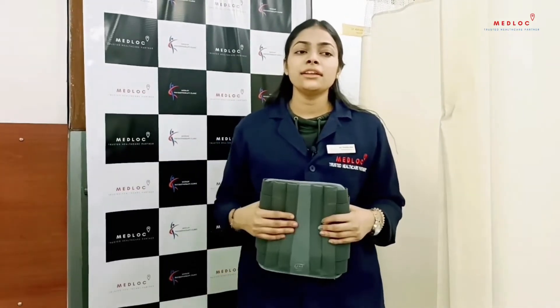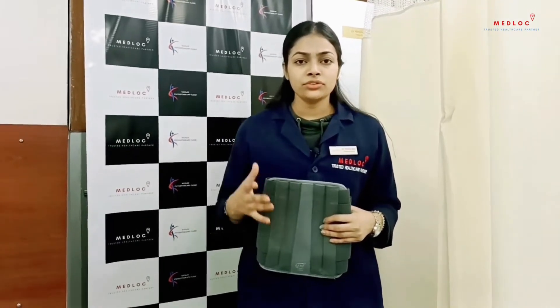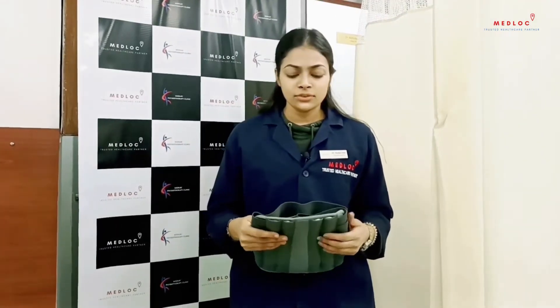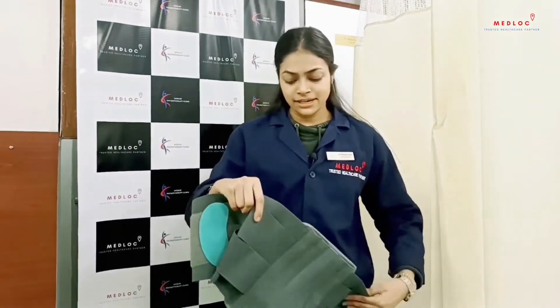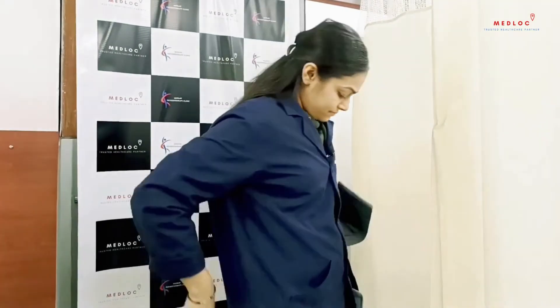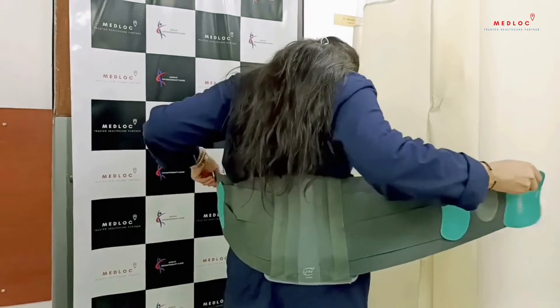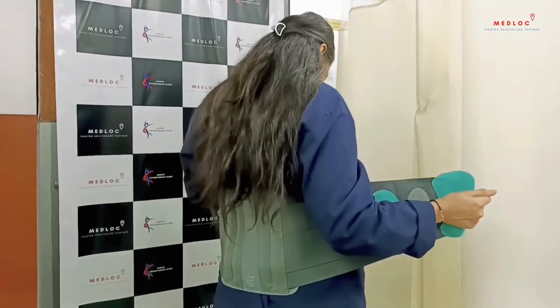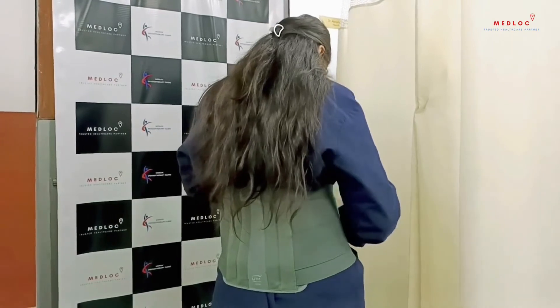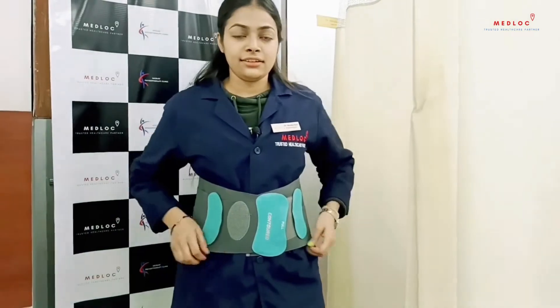It helps maintain the natural curve of your spine. Take this belt and like this you have to place it — this is how you have to wear it. Make sure the belt is of your correct size.